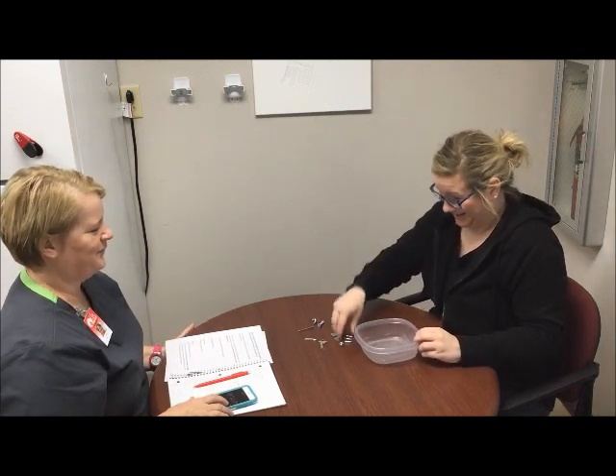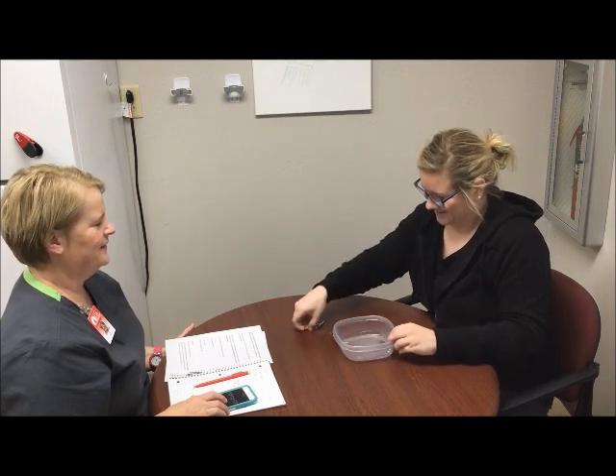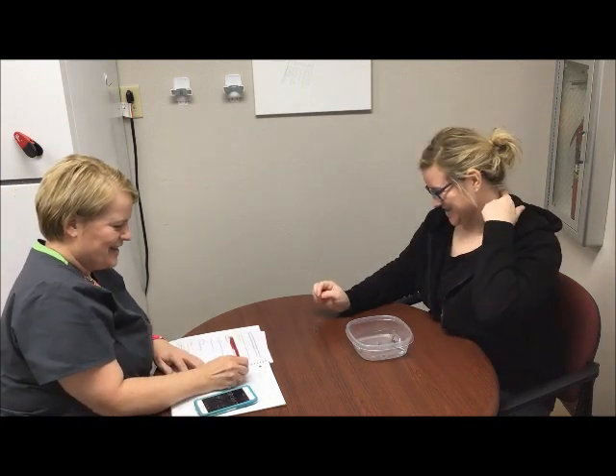Get those all spread out for you now. Ready? Go. Good. Good. And now we're going to do your left hand.